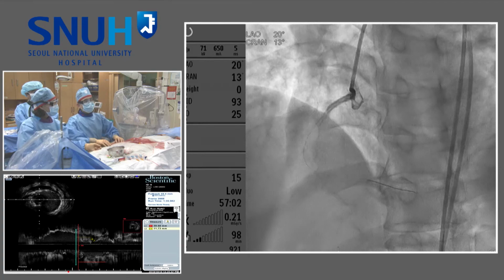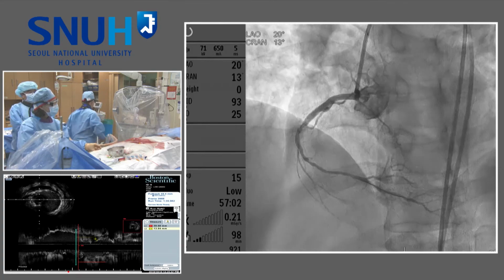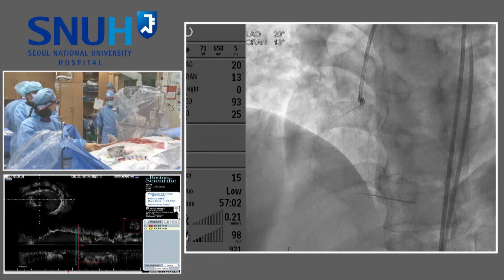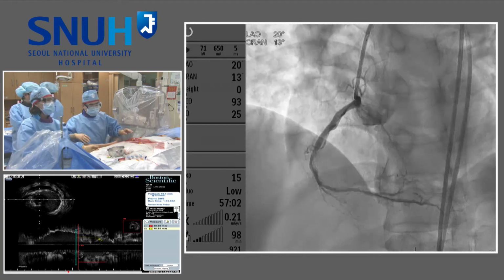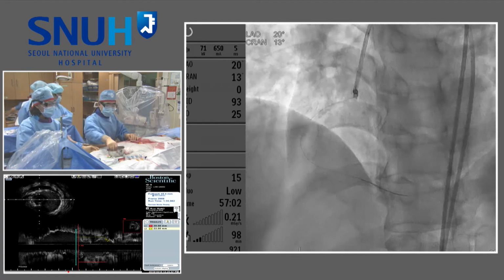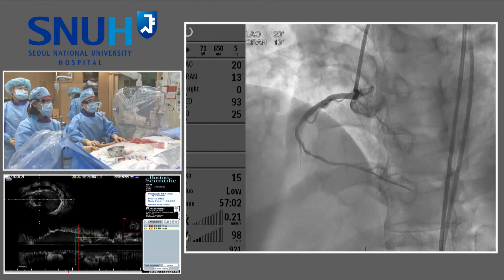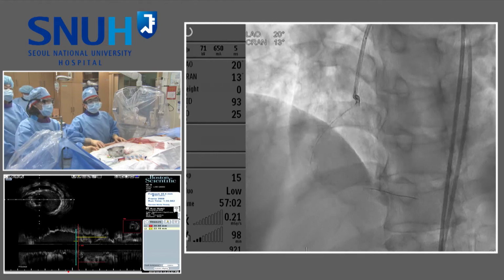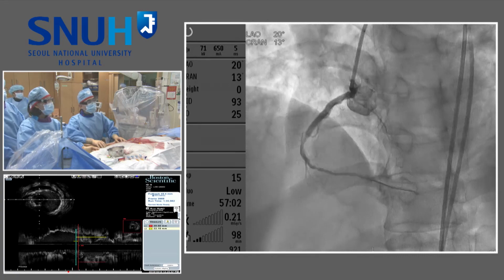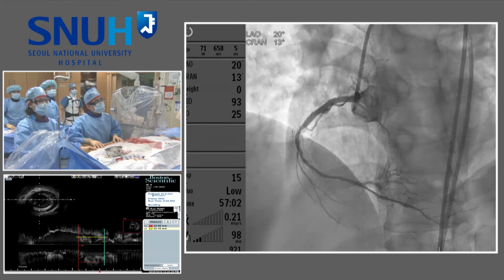I'm happy with what I know, because most of the audience don't know the real fact. How about a short stent versus a 23 long stent? Short stent, raise your hand. What length, based on the IVUS? Length is 22 or 20. Okay. If we add 2 or 3 millimeters of overlap, then the more distal length will be the right length.